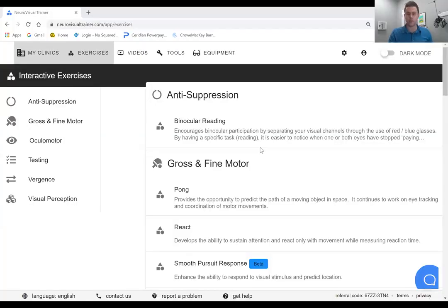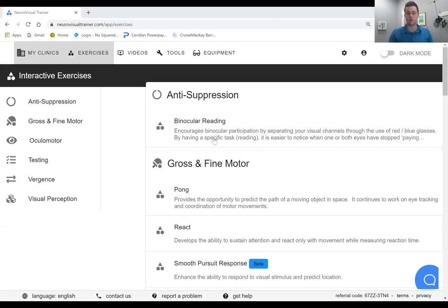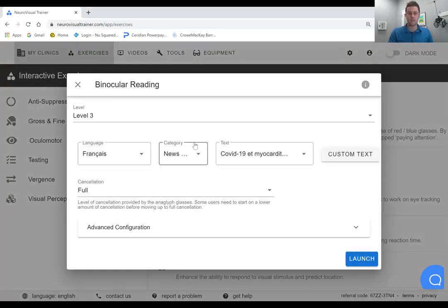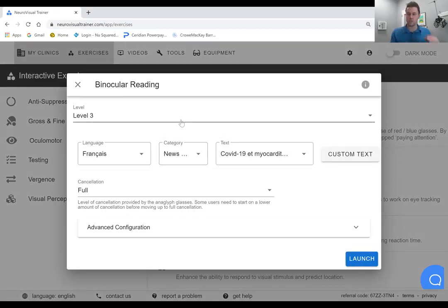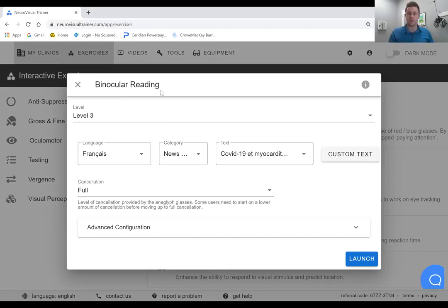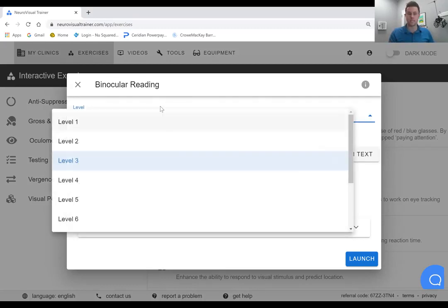We've gone through and discussed a bit of the binocular reading, that traditional MFBF reading that you can do with red green glasses or red blue glasses. What's been implemented or modified here is you can still choose the level of the reading, which is going to be the size from levels one to ten.